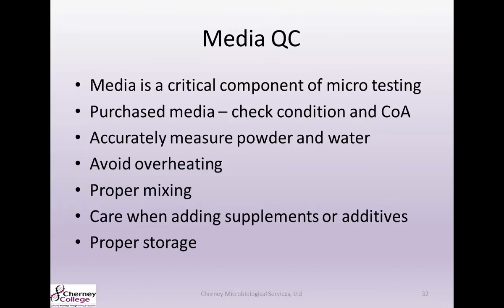Make sure that you're avoiding overheating, make sure that you're properly mixing all your media, make sure that you check the pH before you use it. All of those things come into play when you're talking about quality control of your media.